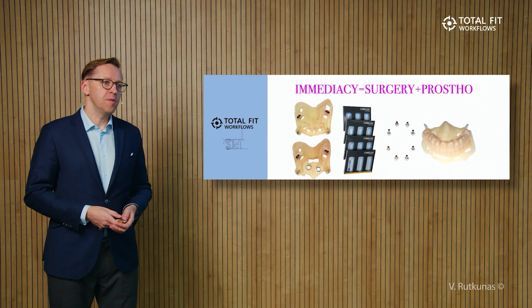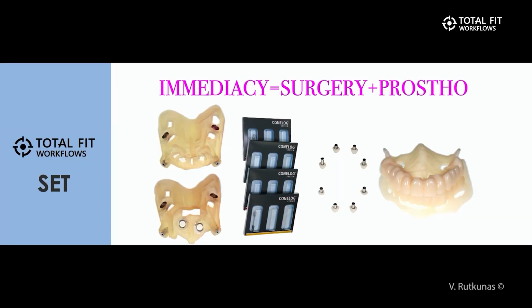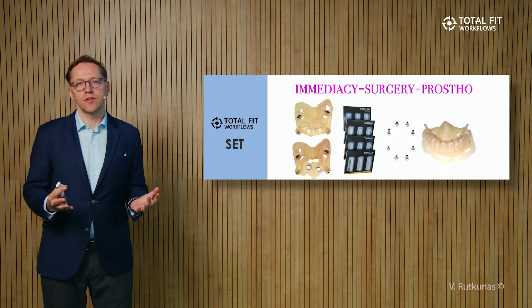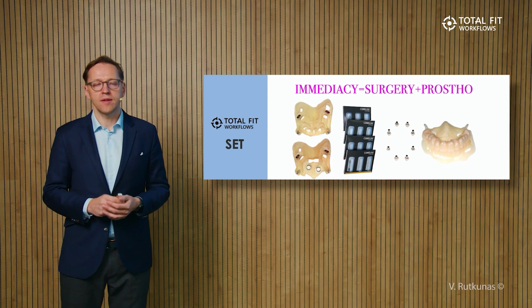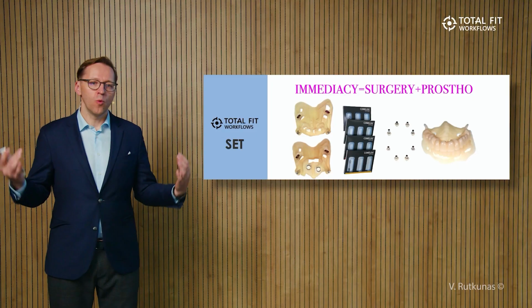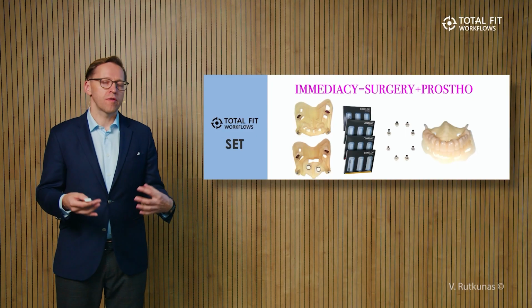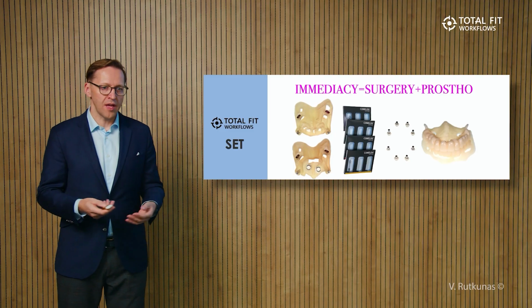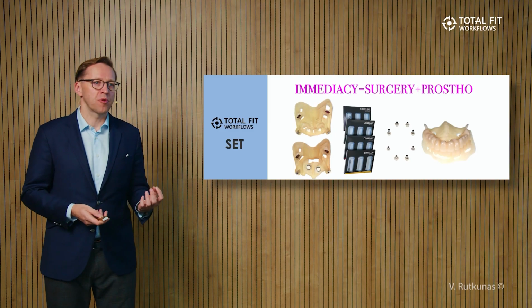Then immediacy. We don't have to apply immediacy in every case, but I'm applying it, I could say, in 80% of cases in my clinical practice. So we have to combine surgical techniques and prosthetic techniques. We have to combine both workflows, surgical and prosthetic, into the planning. We have to fabricate the guides, immediate prosthesis, or healing abutments.